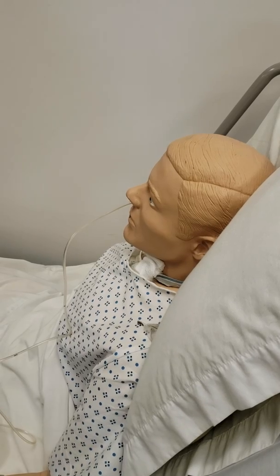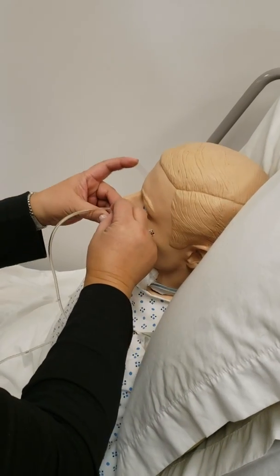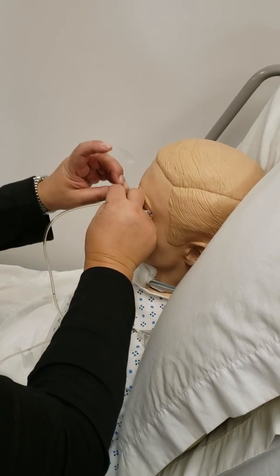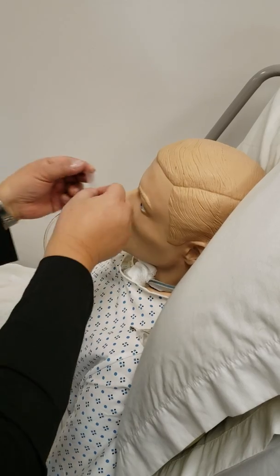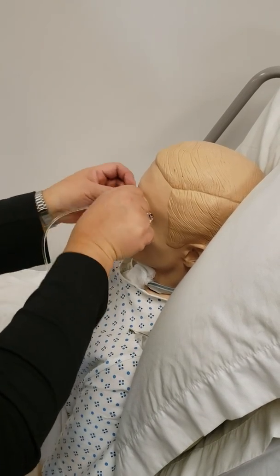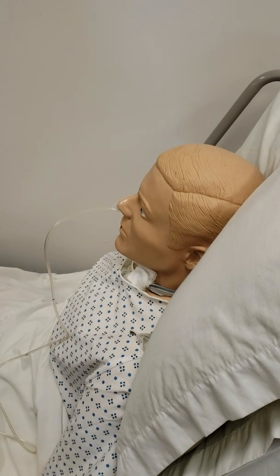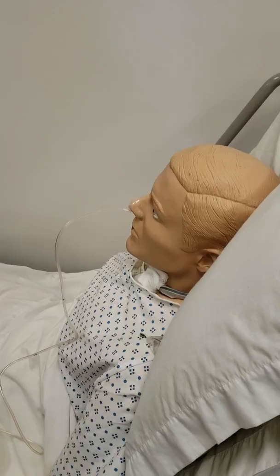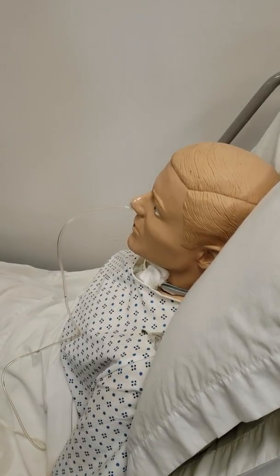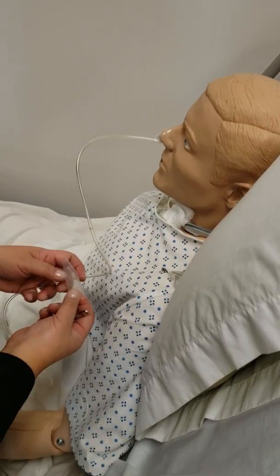And you have to tape it a weird way around the nose. The hospital usually has a nice securing device, but you can do it like this. And we have this thing over here, so that it's not gonna get tugged.